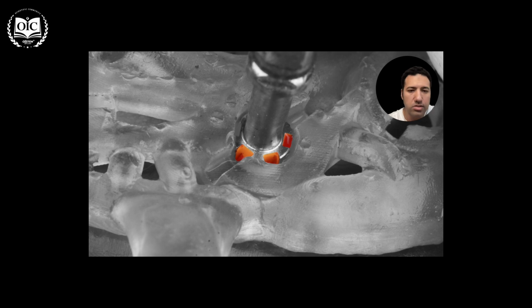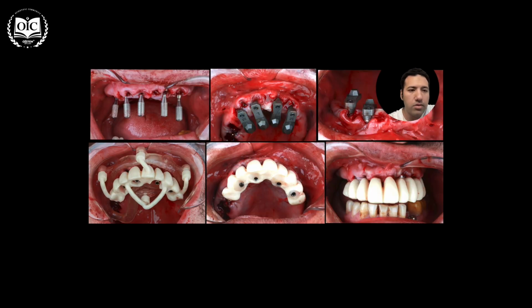In these situations, the implants have multiple divergence angles, and we don't need to work freehand and get stuck at the end of the surgery with non-parallel implants. So here they have multiple divergence angles, yet we have parallel multi-unit abutments because we chose angled abutments and timed the multi-units well with the yellow marks on the drills. Now we have parallel multi-unit abutments.